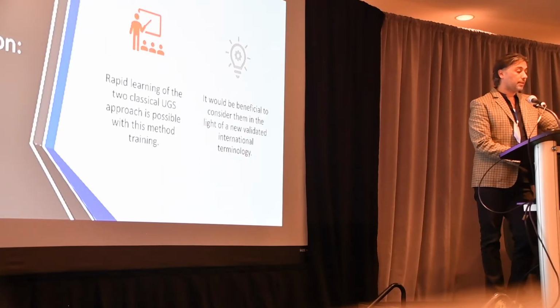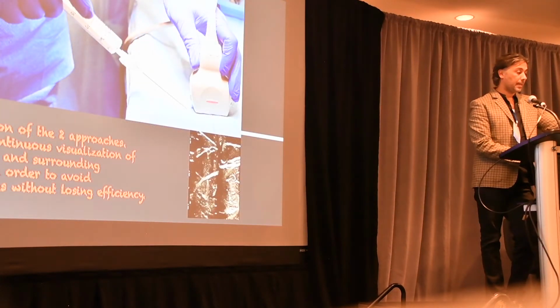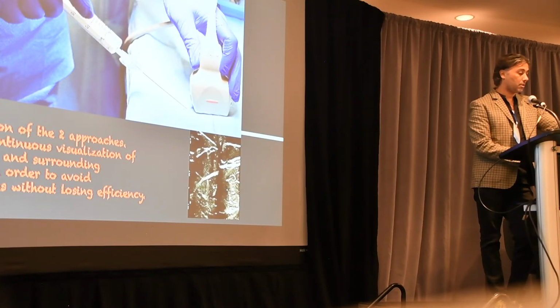So we can conclude that rapid learning of the two classical ultrasound-guided sclerotherapy approaches is possible with this training method. It would be beneficial to consider them in the light of a new validated international terminology. And the original in-plane short axis is a combination of the two approaches, and it allows continuous visualization of surrounding structures in order to avoid complications without losing efficiency. Thank you.